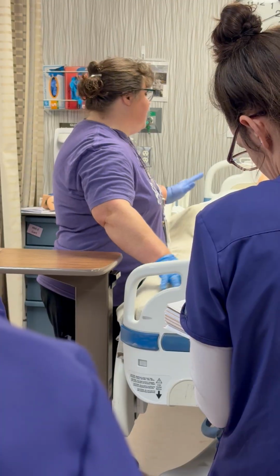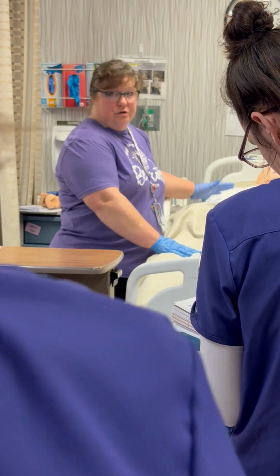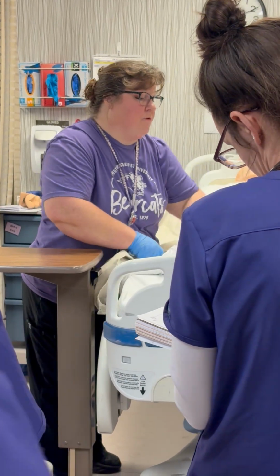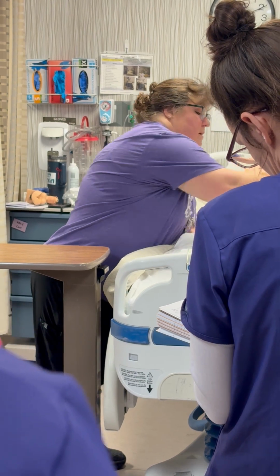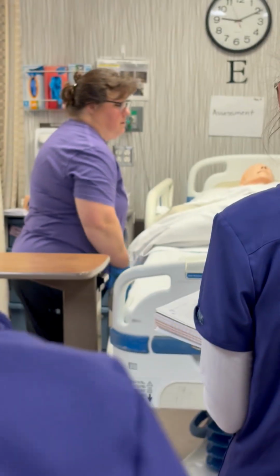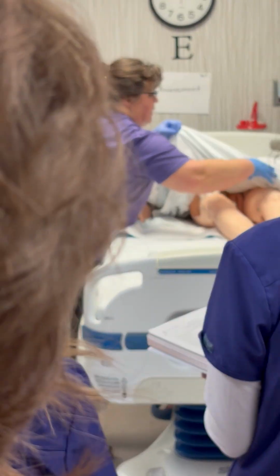And then you're gonna tell your patient, okay, we're gonna do some peri-care, so you gotta do your peri-care first. So you're going to put your blankets and roll them up. I'm gonna expose you, and you're gonna roll them up. Okay, you're gonna roll their gown up.